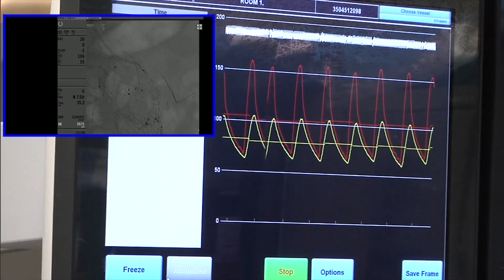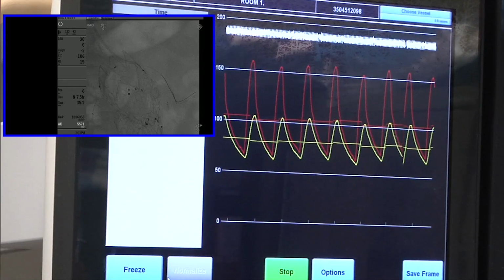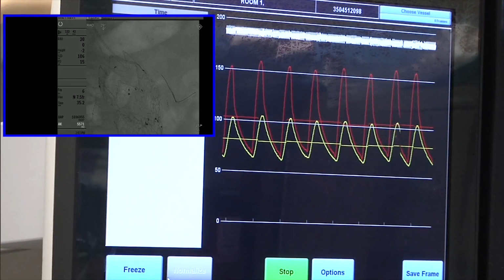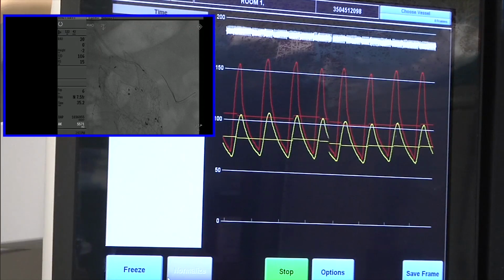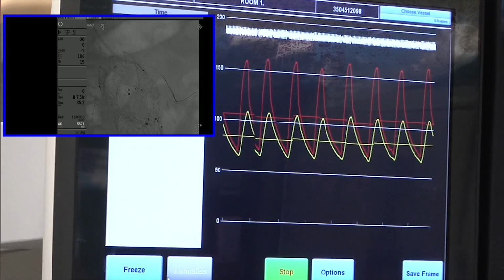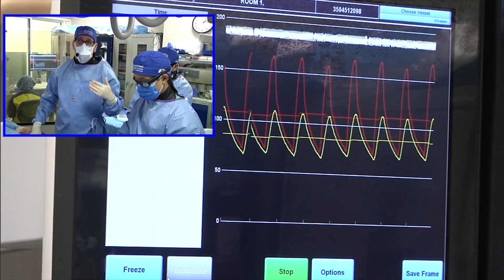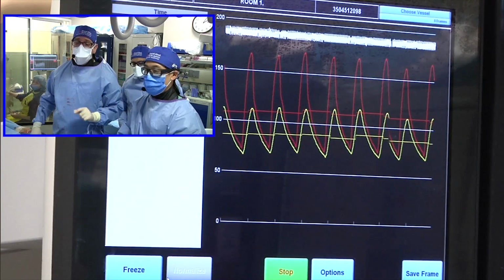Clearly, if we plan to do an open repair, we're going to have to take this into consideration, whether we want to do an open renal bypass or whether we want to do preoperative renal stenting or some variation on that. But I always think it's a very good idea, no matter whether you're doing it in the setting of aneurysmal disease or non-aneurysmal disease, to measure a gradient before you do renal stent placement, and to make a decision about whether you in fact are going to revascularize the renal arteries based on a translesional gradient.